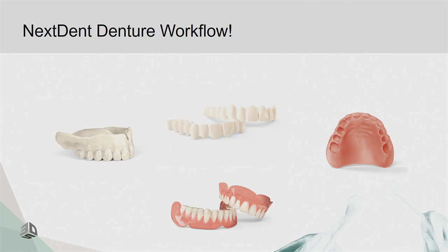We tested this, so the MFH with the Denture 3D Plus material glued together stick together very well. We did some testing, of course, but it's also possible to print each and every tooth separately. It's a little bit more work, but you can then glue them into the pockets. We also tested it with milled arches, and we tested it with stock teeth. You can bond them with cold cure acrylic.